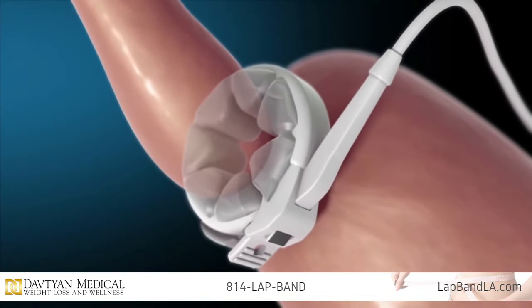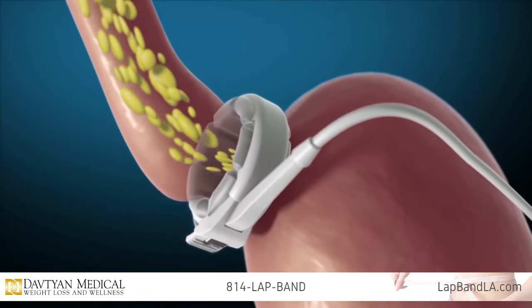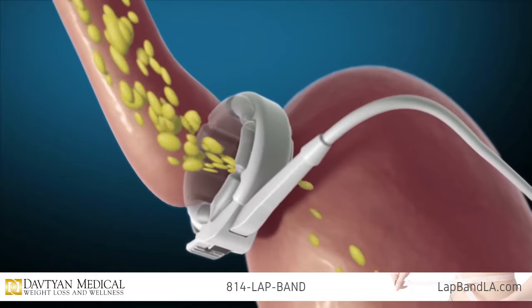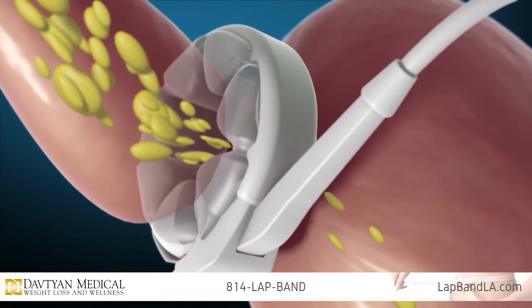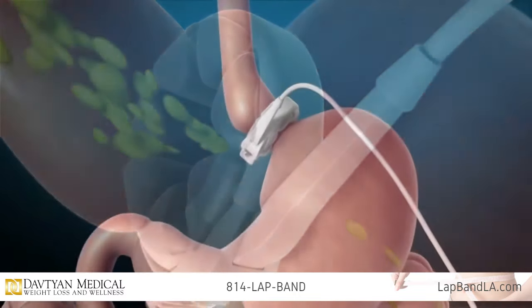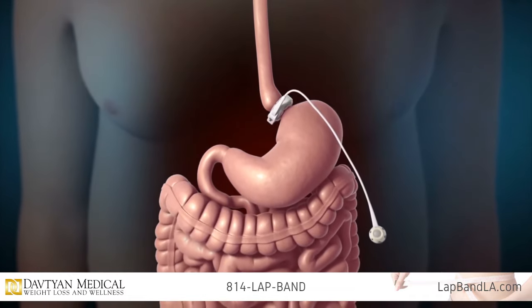As the band inflates, the stomach outlet becomes smaller. This helps reduce the amount of food you eat and slows the emptying into the lower stomach, helping you feel full sooner, stay full longer, and reduce hunger urges. This procedure does not require any rerouting or stapling of the anatomy.